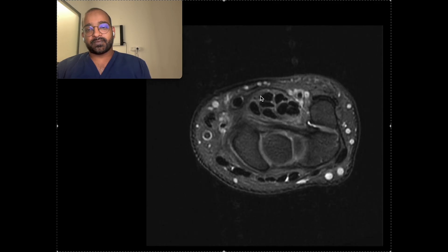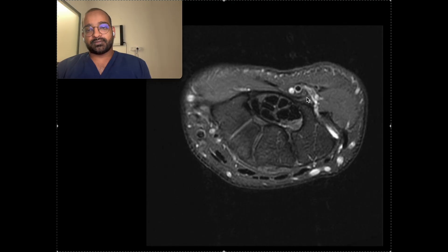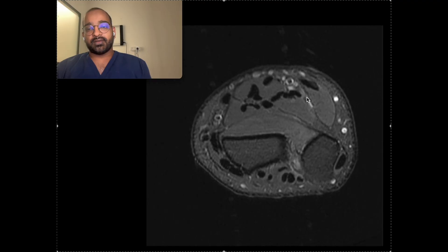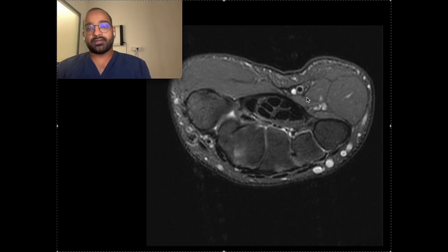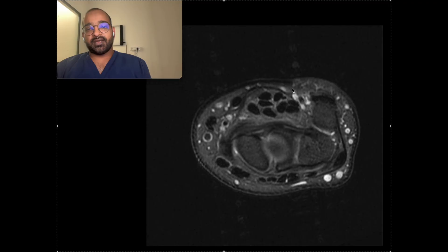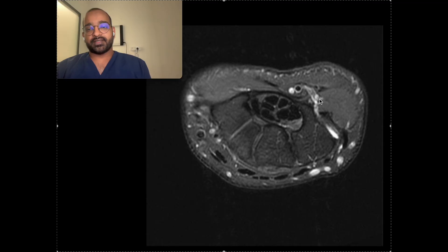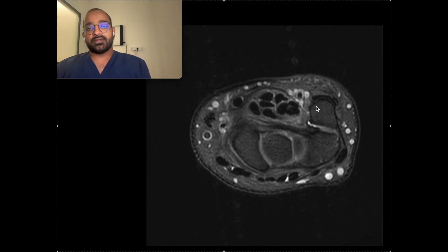Here are the ulnar nerve and ulnar vessels — this is the ulnar nerve. The ulnar nerve runs in a canal called Guyon's canal. Guyon's canal has a floor formed by the flexor retinaculum and transverse carpal ligament, with small fibers superficially from the flexor retinaculum. On the ulnar side we have the pisiform bone and on the radial side we have the hook of hamate. This is Guyon's canal.